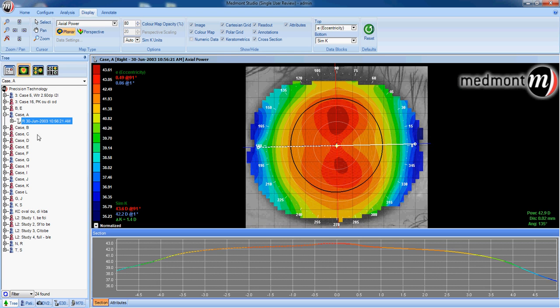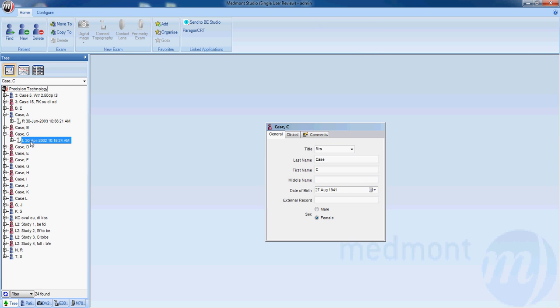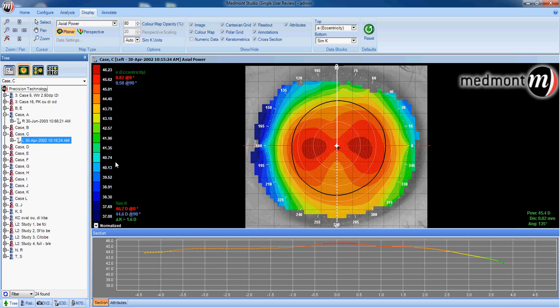Compare that to this particular patient where you see against-the-rule corneal astigmatism of a very similar amount of corneal cylinder — 1.6 diopters on this against-the-rule eye. But again, we see centralized corneal astigmatism.